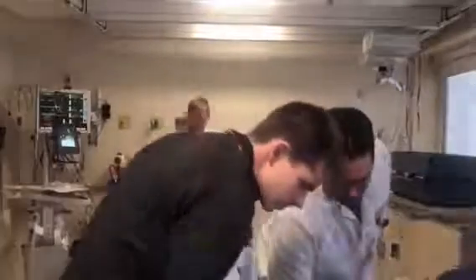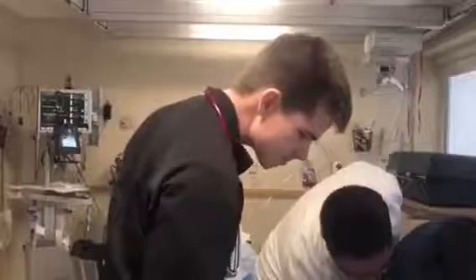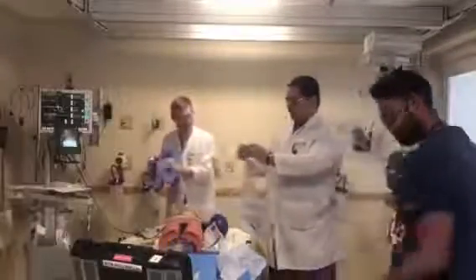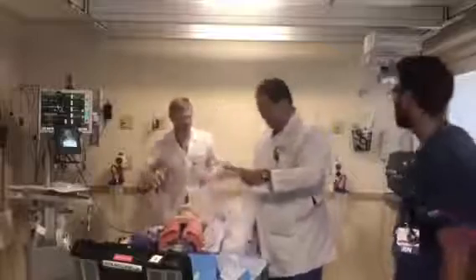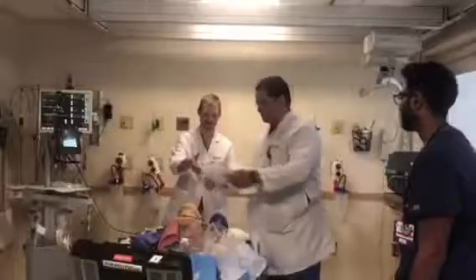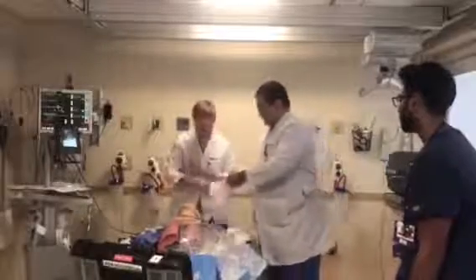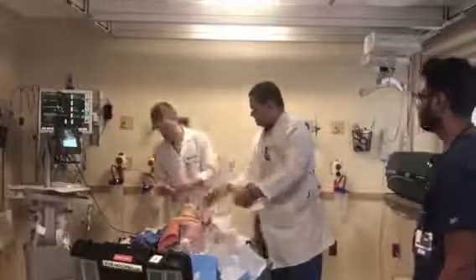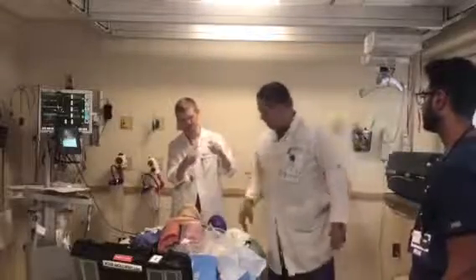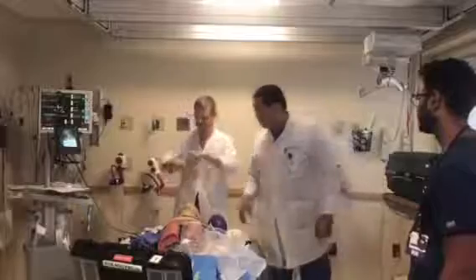Fourth row. This is called the intubating LMA. This one here. Oh, okay. All right. So it's a whole kit that comes in. So if you see this, you're gonna say, why do I even need to go with the other LMA? The other LMA is only made for an ambulance or something. Quickly, just put something. Right, here you go. So this is exactly the same thing, but you have two advantages. Number one, you don't put your finger in anybody's mouth, and number two, you have the lubrication there.